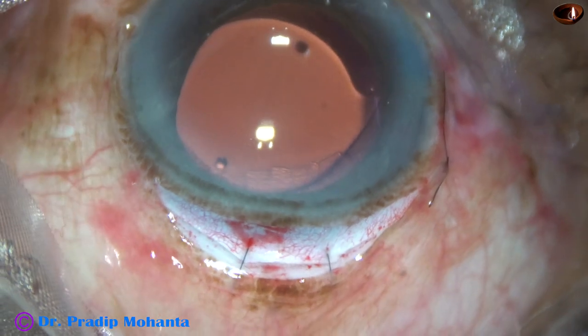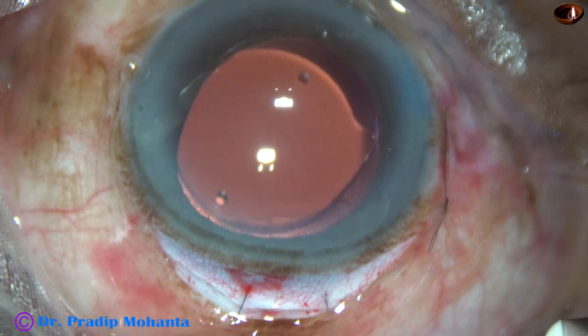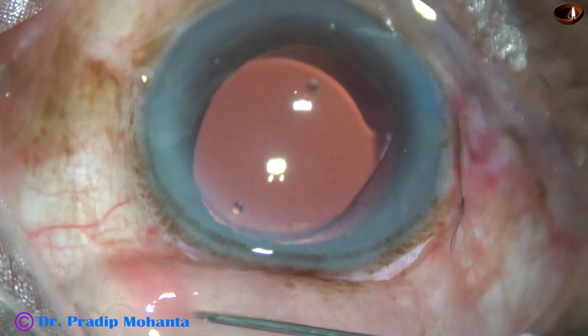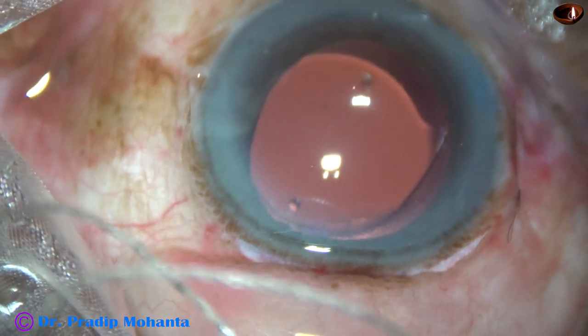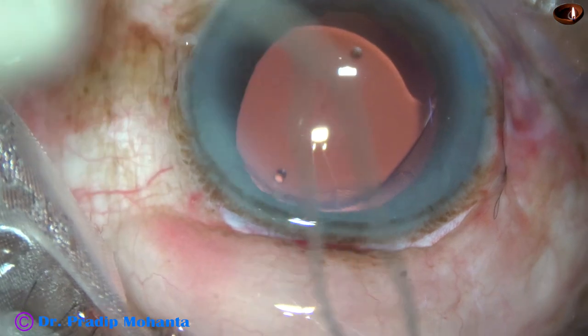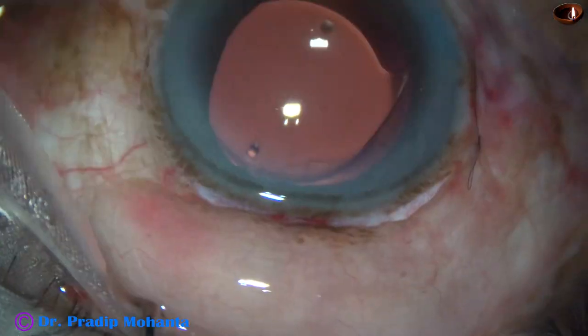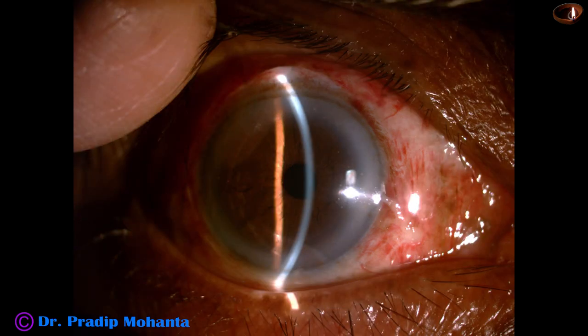Now I am going to inject gentamicin and dexamethasone subconjunctivally and cause some chemosis. This will oppose the rest of the conjunctiva to the limbus. We are going to see some post-op pictures taken two days after the surgery — the cornea is absolutely clear, the anterior chamber is quiet, the pupil is round, and the wound is nice.